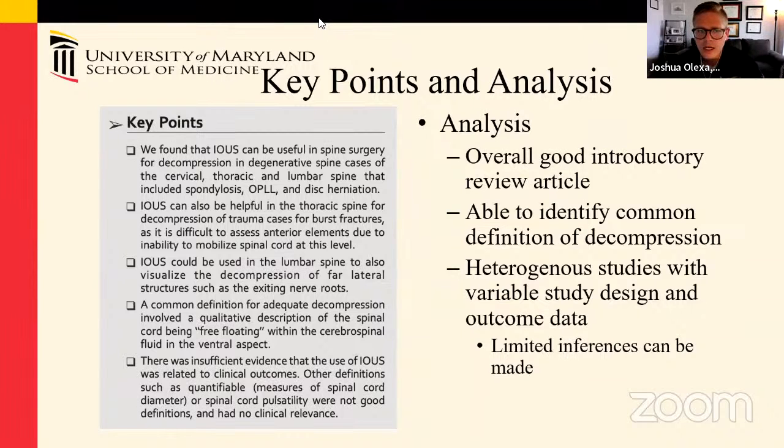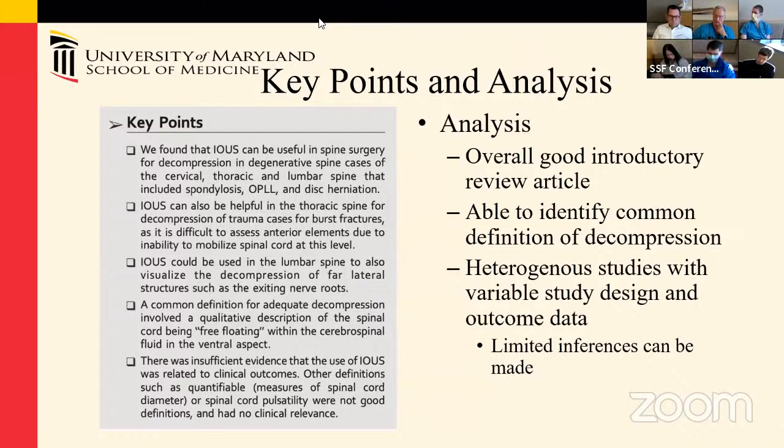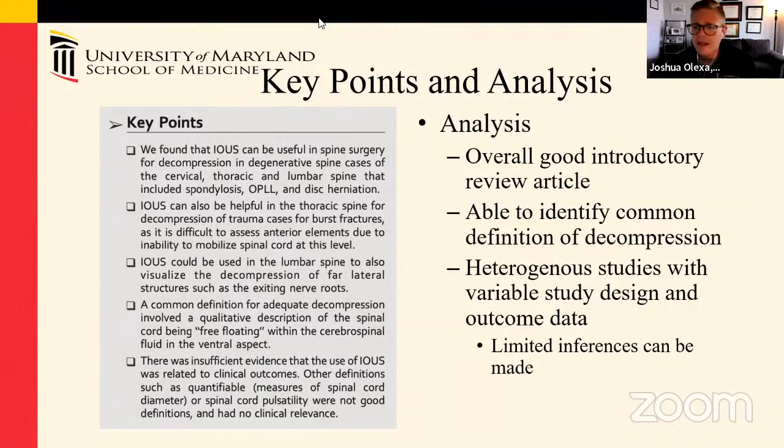The first question, as far as, I'm sorry, can you repeat the first question? Distribution, cervical, thoracic, lumbar, and indications. Yeah, so the distributions, I guess, as far as the reason why they used the ultrasound, a lot of these were really radiographic studies that they showed it.